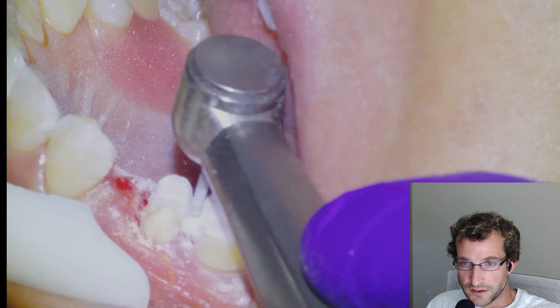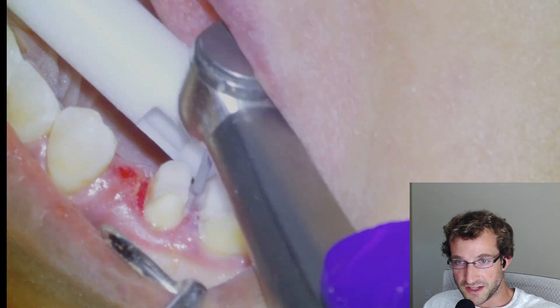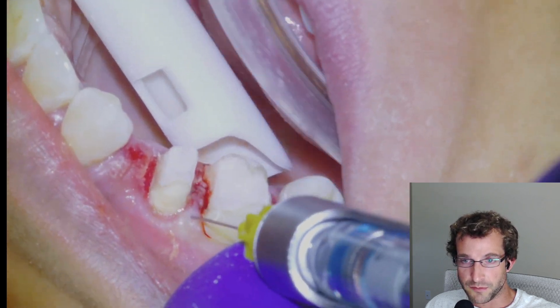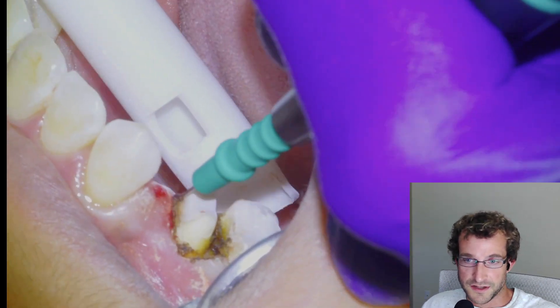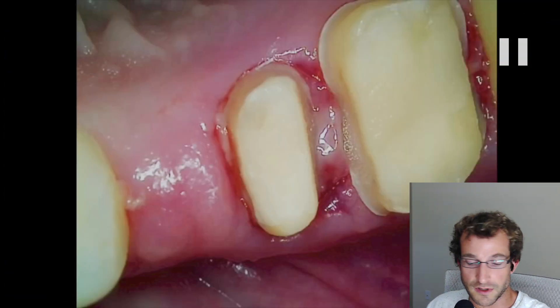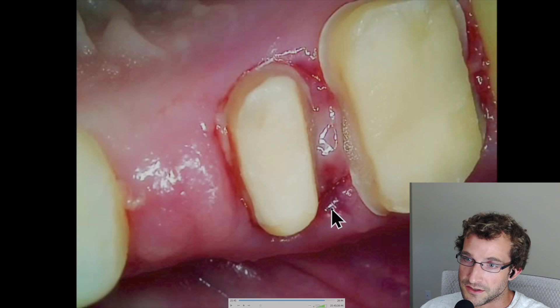Once we've isolated our margins down to the natural tooth structure — which is going to be deep — we're going to take our electrocautery unit and begin ablating gum tissue so that our scanner can pick up the margin. We're going to put some arcticane directly into the site both for hemostasis and for anesthesia. We're using the electrocautery tip for gingival isolation. There's the 1-6 and the 1-5. You can see the electrocautery pretty much down to the bone — it does a good job with hemostasis and you can remove a whole bunch of gum tissue if you need to.